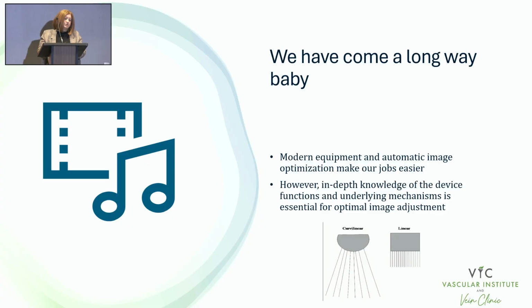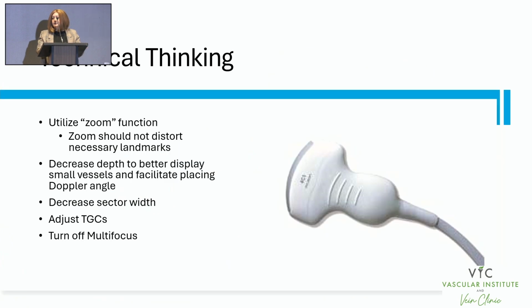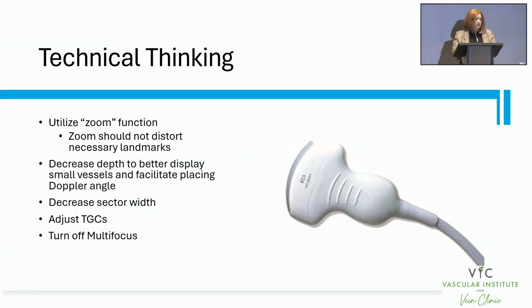I had a mentor, Terry Needham, who is no longer with us. He was British, and he said, Tina, you've not done a good ultrasound unless you've touched all the buttons. So I don't care how good the imaging equipment gets and how much it does for us, you still have to optimize your images and touch the buttons. And in-depth knowledge of the device and the underlying mechanisms is essential to getting good images.